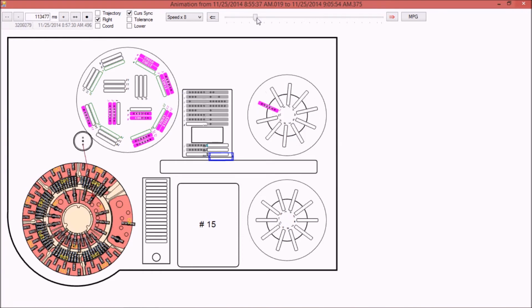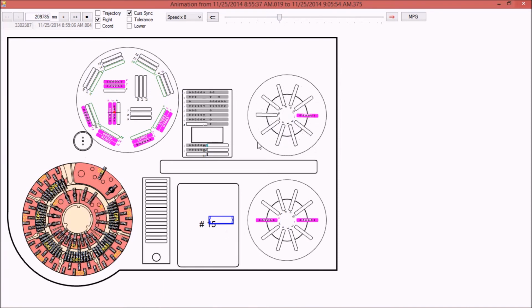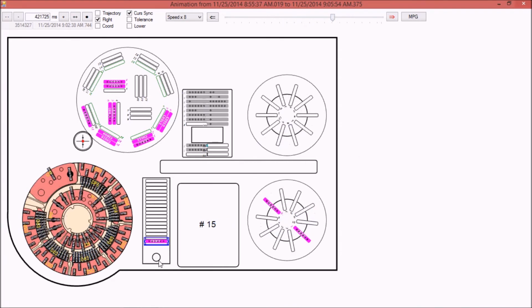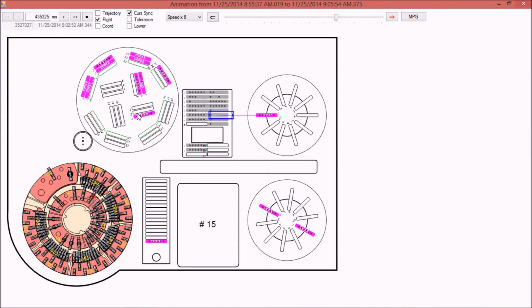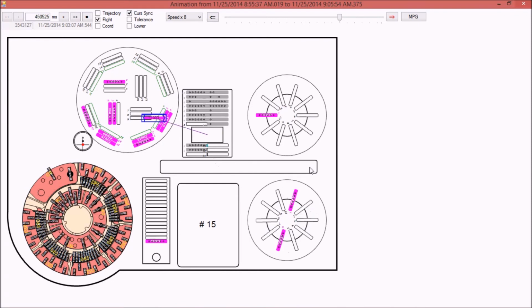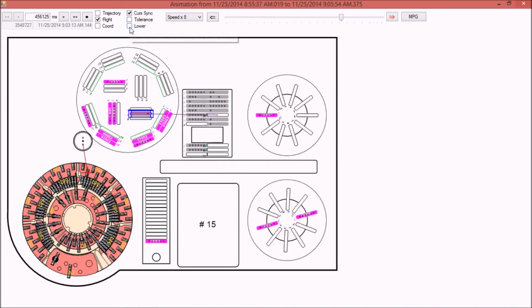Now we move to a little bit further situation. Here we can see a different move. This is another arm which moves a gripper. This gripper is capable of moving all these consumables around in the instrument. For instance, now we see that this gripper has taken one of these consumables and has put it into the centrifuge. Now, after a while, the centrifuge will start spinning. Now, what you've seen here is that the gripper went into this slit that goes to the, let's say, ground floor of the instrument, on which we have actually a drawer containing a significant number of consumables.